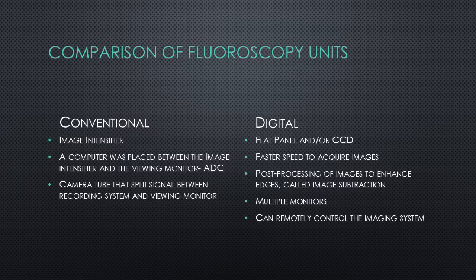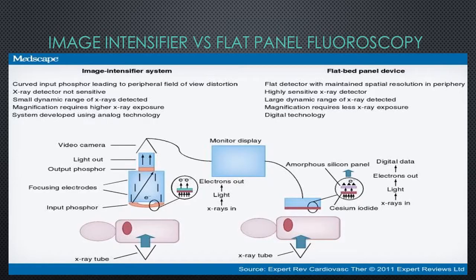These dynamic images have the ability to be post-processed with window and level to be able to view various shades of gray. The newer units that use digital are used in specialized applications such as vascular imaging because the anatomy requires fast acquisition and great spatial resolution.